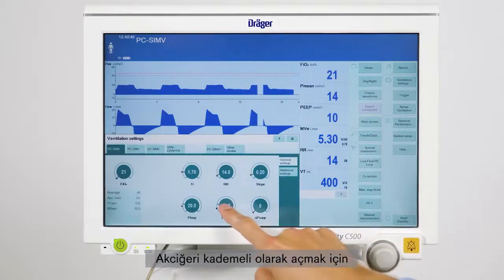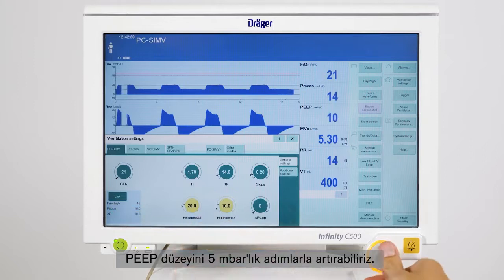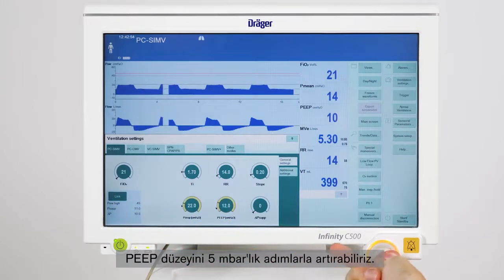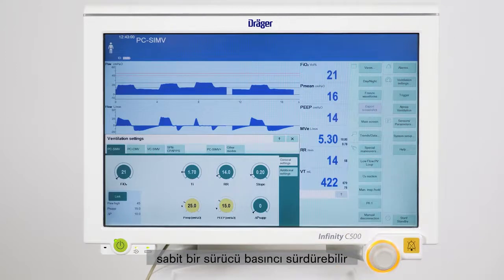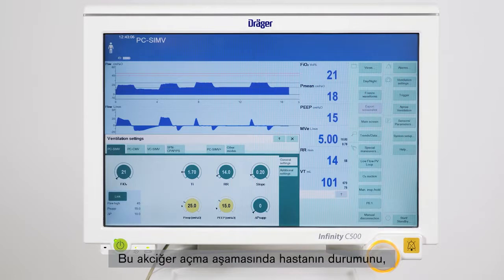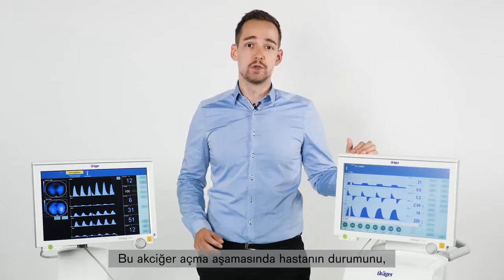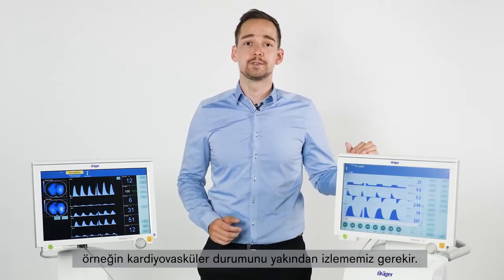In order to gradually open the lung, we can stepwise increase the PEEP level in steps of 5 millibar. We can use PressureLink and QuickSet to keep a constant driving pressure and apply the increased PEEP levels immediately. During this recruitment phase, we have to closely monitor the patient's condition, for instance, the patient's cardiovascular status.